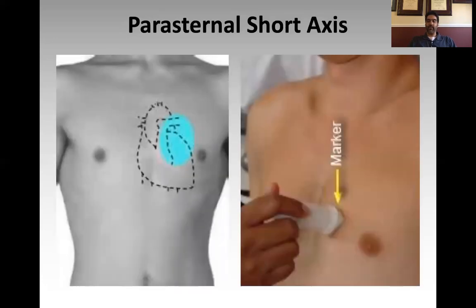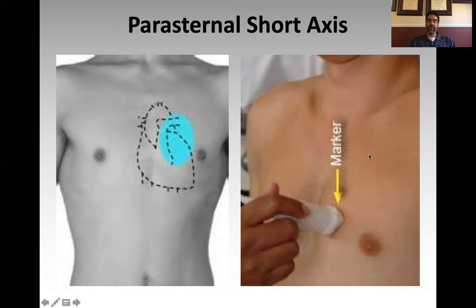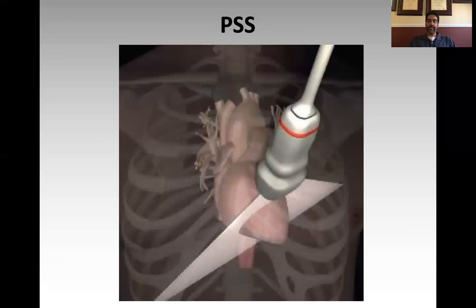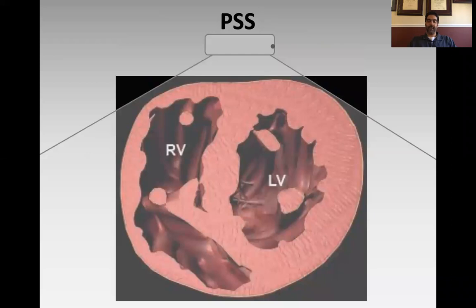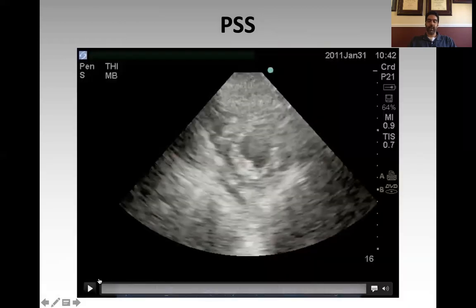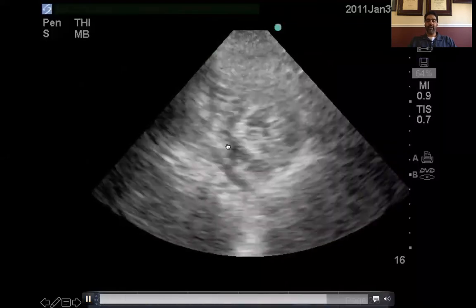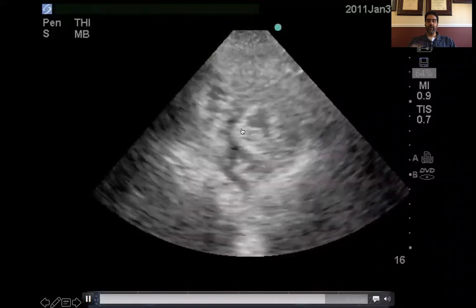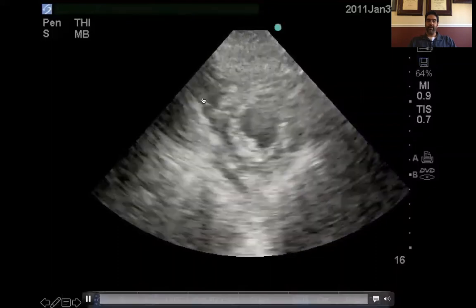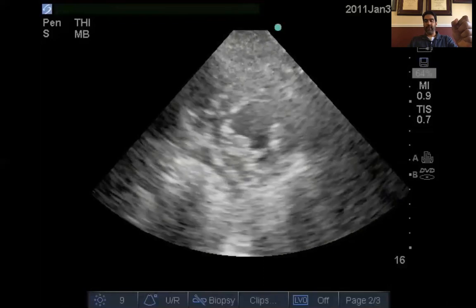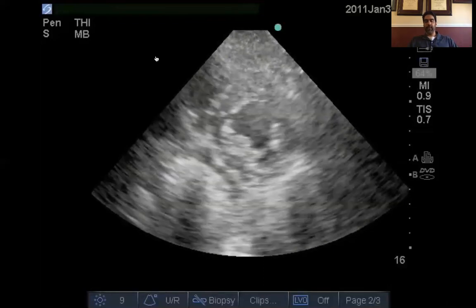The next view is the parasternal short axis. Since the long axis runs one way, the short axis runs perpendicular to it. To achieve this, take the indicator from the parasternal long view and rotate it 90 degrees so it points to the patient's left shoulder. You'll get a cross-sectional cut through the heart. On the image — with the dot on screen right — you'll see the RV on one side and the LV on the other. In a normal heart, the LV appears as a round chamber you're looking down into, like a barrel, and the RV is a conical structure beside it — I like to think of it as an ice cream cone.